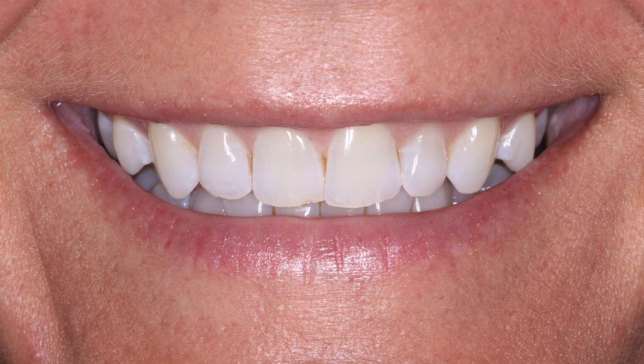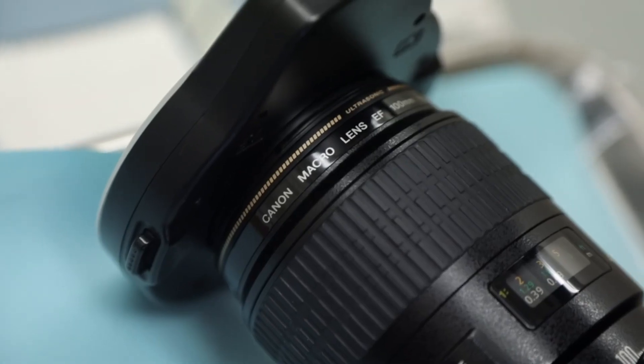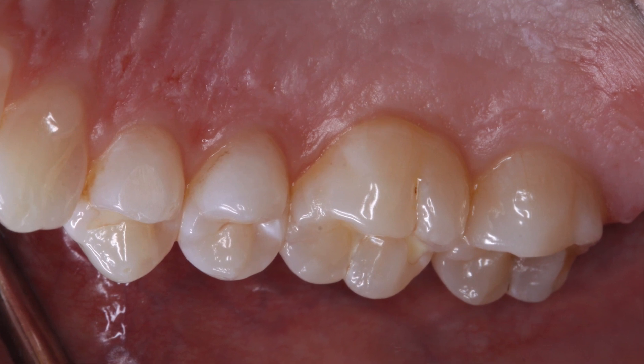This is a really good setup because you're going to get high quality photos. Even the cheaper DSLRs are still going to give you great quality photos. This specific camera is broken down into three major parts: you have the body, you have the lens, and specifically for dental photography I like to use a macro lens. This is a 100 millimeter macro lens that's going to allow you to get real up close and personal with the patient's teeth.